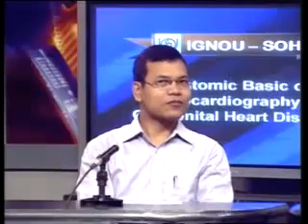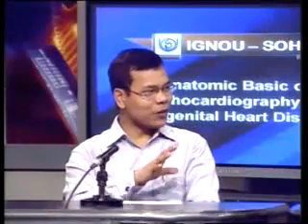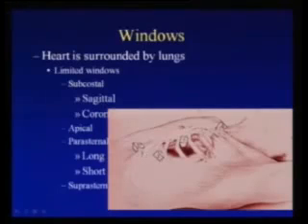Yes, and the same applies in the chest X-ray. In chest X-ray, we say cardiomegaly is more than 60% in the neonatal period. It is because the heart is horizontally placed, not because the heart is enlarged in fetal life. So the ratio is practically the same, but because the heart is horizontally placed, the dimensions in that particular axis will be different than in the later age group. All our students should remember this aspect, because when they practice, it is one of the important issues. Then we start the echocardiography investigation from the subcostal view.